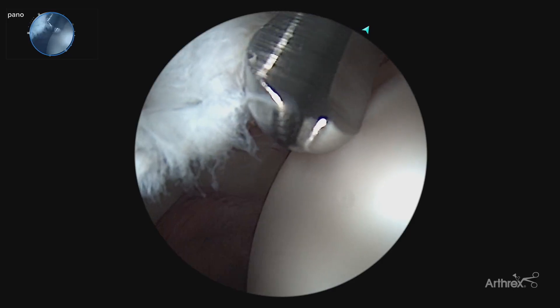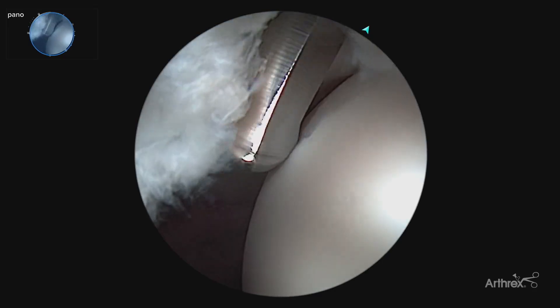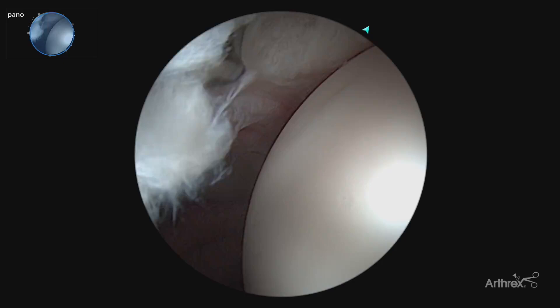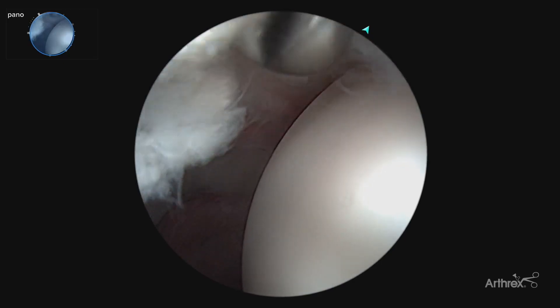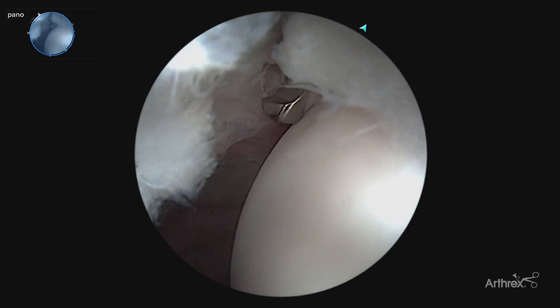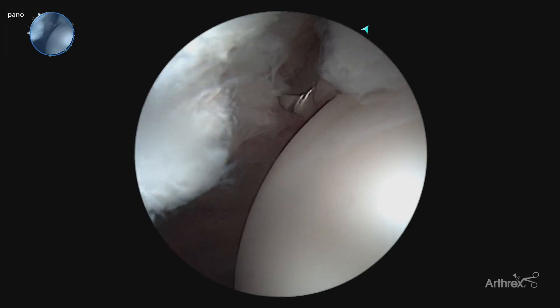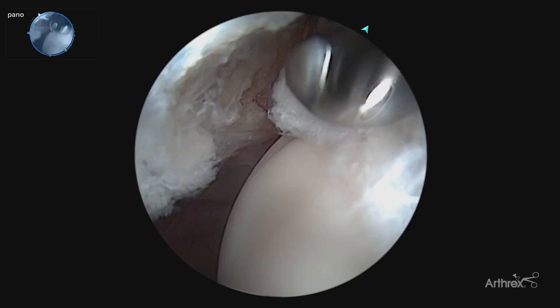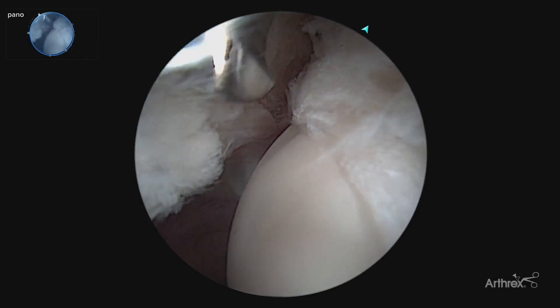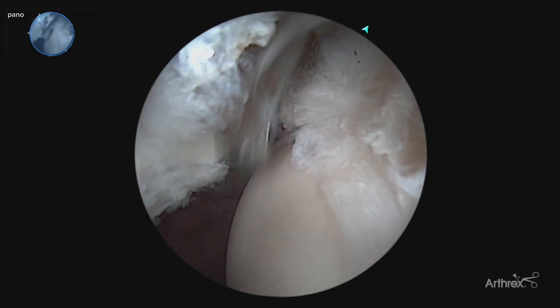Our blunt tip here is shown on the femoral head, protecting that femoral head, and any kind of oscillation that's required has an extra fail safe there. We are now finishing off our interportal capsulotomy. If we would like to take it further we can, and that makes a nice clean and quick interportal capsulotomy. Now we are starting to get better visualization and we can start moving forward with our hip arthroscopic labral repair.